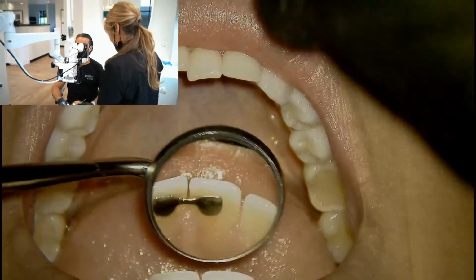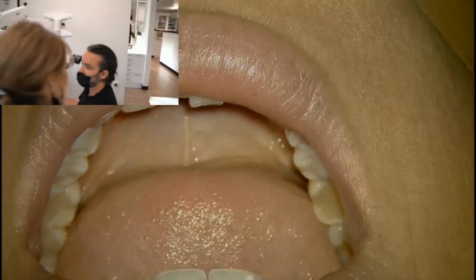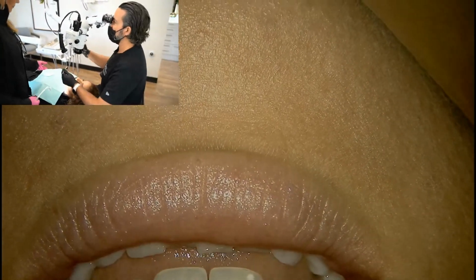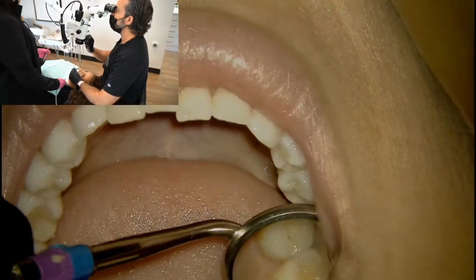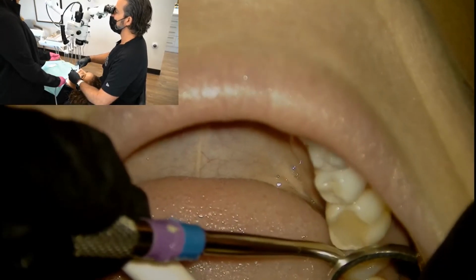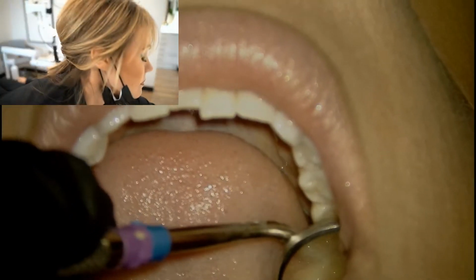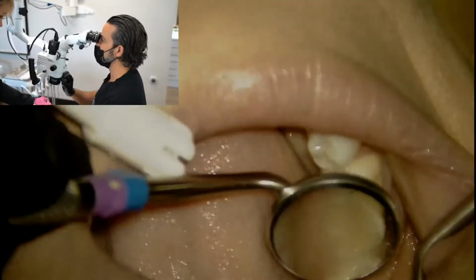All right, so everybody's a dentist here, I suppose, so doing an examination is nothing new, but maybe just working around the patient and in the mouth is unique to this. So I'm going to do a little bit of parfocaling, and like I said, do you want to give me something to retract back here? If you want to get another mirror to pull back a cheek for me, and then just suction.